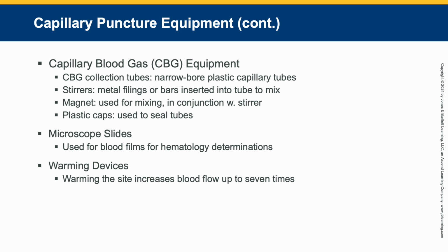Inside of this tube is heparin. There is a green band around the edges of this, so you're going to see that green band on the tube.